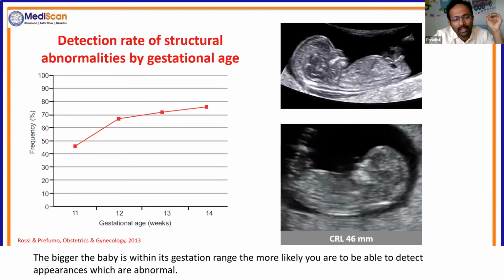At this point of time, I would also want to reiterate that in the first trimester assessment, a liberal use of the transvaginal scan would enable us to identify the abnormal appearances much better than the transabdominal scan. And in any patient, if we have the slightest suspicion of a difference in the anatomy on transabdominal scan, or there is a challenge in the imaging of the fetus on transabdominal scan, we should use the transvaginal scan, and only then would the imaging be complete.